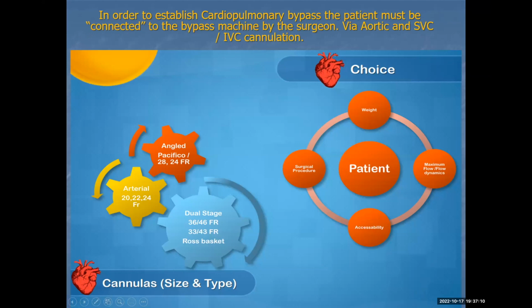So basically, I'm saying we've got a checklist. A bit like a pilot, before they take off, they have a distinct checklist. We usually check the fluids and everything else with another member of staff. So there's a double check safety mechanism, and all those things are supposed to be signed off by the anaesthetist and surgeon at the end of the case, so we know that they are happy with them.